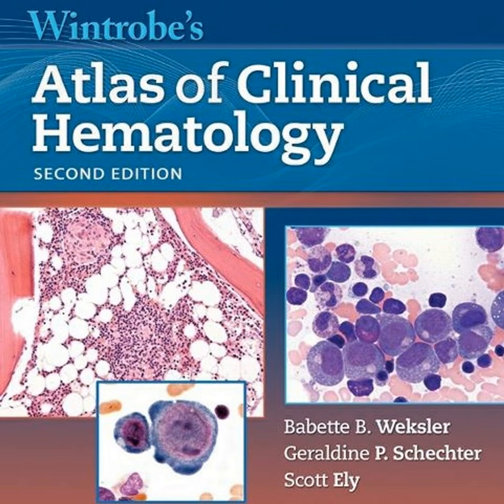So the full diagnosis requires iron studies. Low serum iron, high total iron binding capacity, and a ferritin level often below 20. And the smear backs this up. You'll see microcytes, hypochromia, and those classic elongated pencil cells.